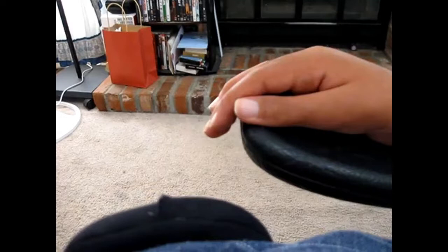He's now at this stage freshman in college, and he's driving around outside of his apartment complex. One of his hands is not by the switch yet. I think it's laying in his lap because that's his reset switch, and we just wanted him to practice driving for a moment. On his right hand, you'll see he has a splint on his wrist.